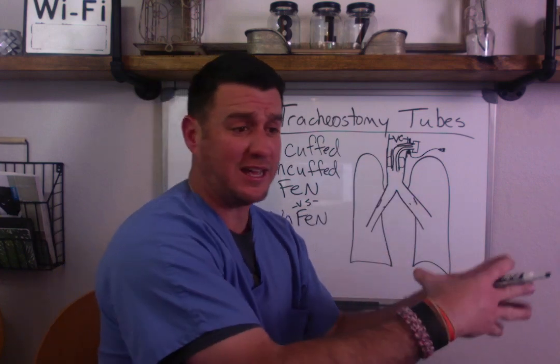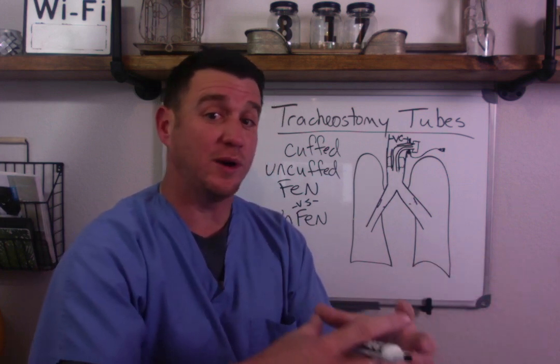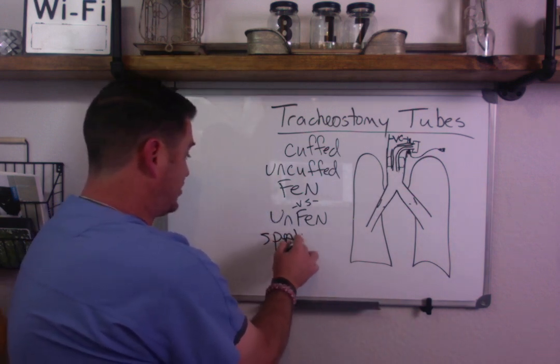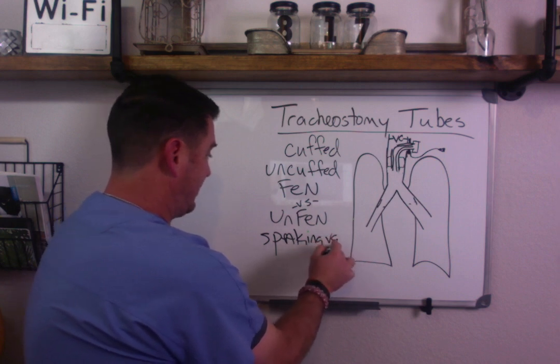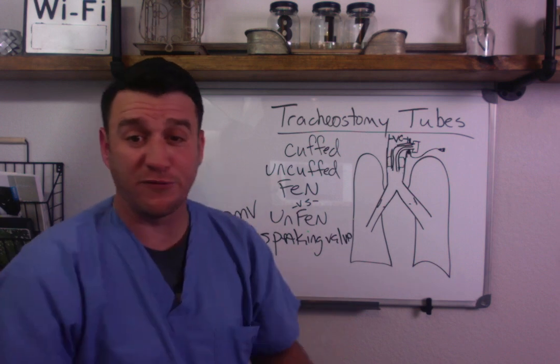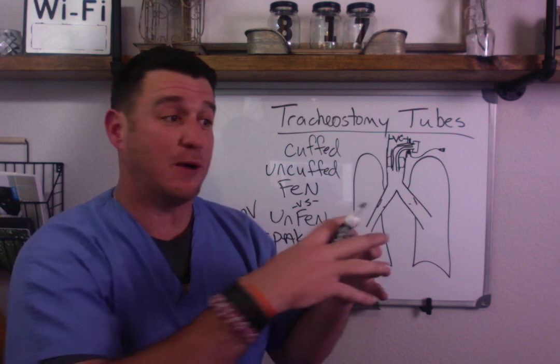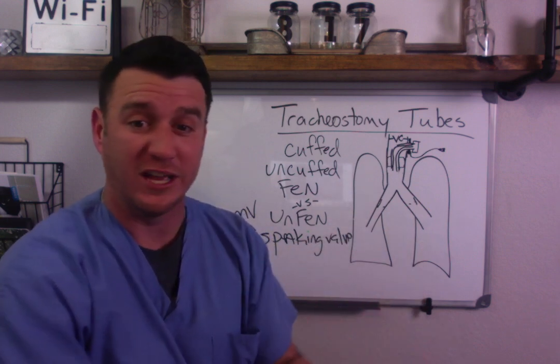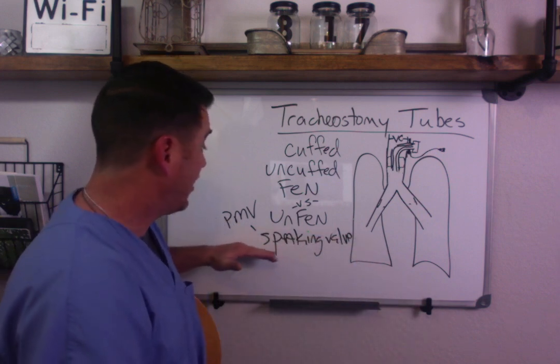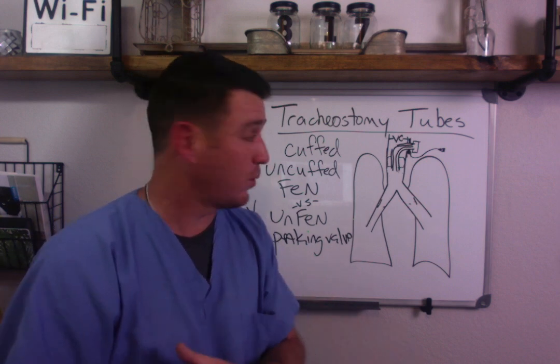Now when this patient comes off the mechanical ventilator at night, and during the day goes onto a speaking valve, so I'm going to write speaking valve here. Now, us old timers, we refer to this as a PMV. PMV refers to the maker of the original speaking valve. This was a patented device under the name of the Passy-Muir valve. We all refer to it as a PMV valve. Well, the patent has expired, and now other companies, such as Shiley, are making standard speaking valves. They all work under the same principle. So that's important to understand.